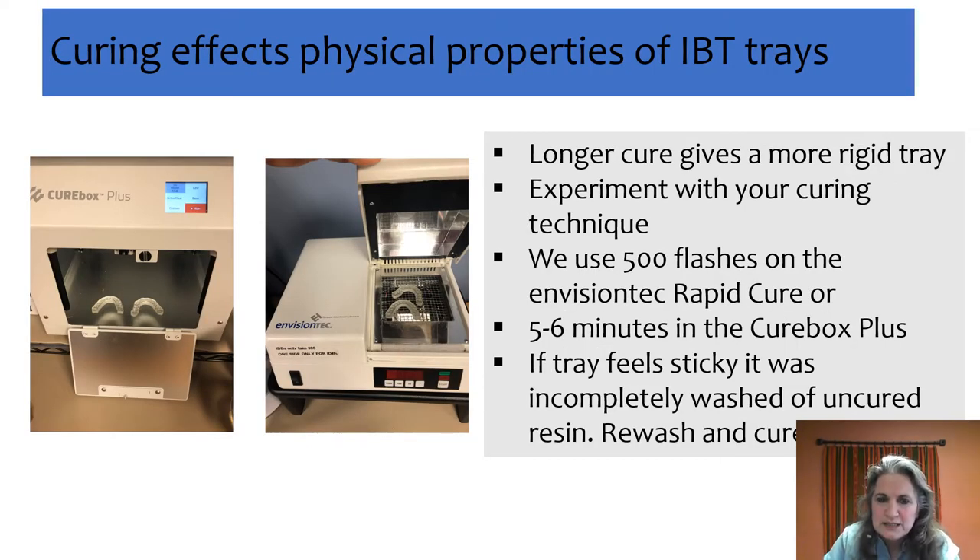Here's where everybody has a little bit of preference. The amount of time you cure the tray will determine how rigid or how flexible it is. I always recommend that for the first couple of trays, print multiple of the same tray and cure them for different times — then see which feel you like as you're seating your brackets and how it feels in the patient's mouth, because we're all going to be a little different there.